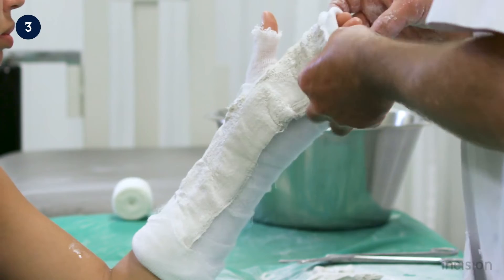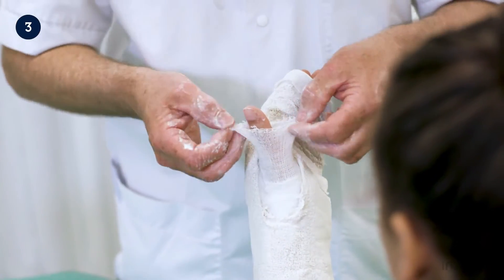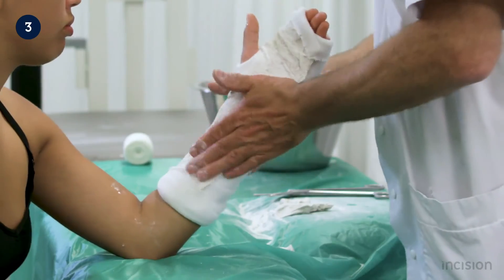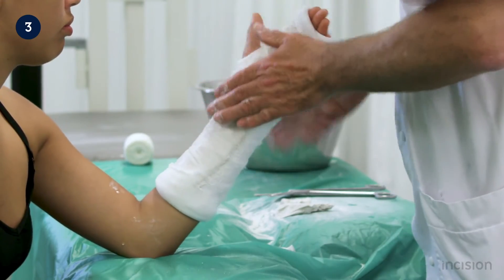The longer stockinette and padding are now folded over the plaster, creating smooth edges. Note how this is done distally, with the tips of each digit left exposed for assessment. The stockinette is also folded back over the thumb.